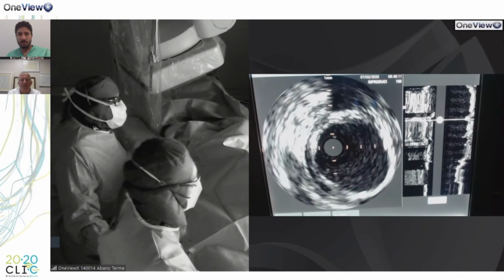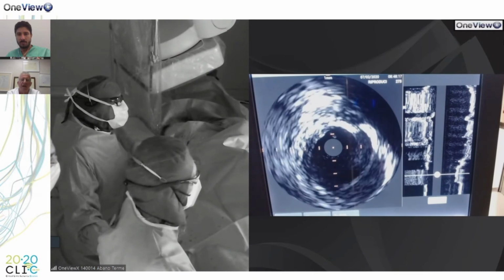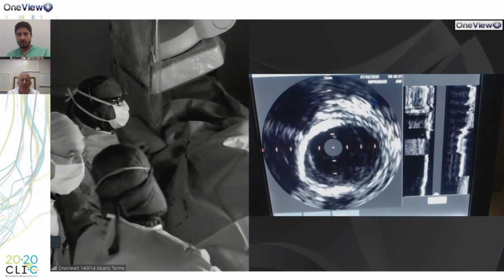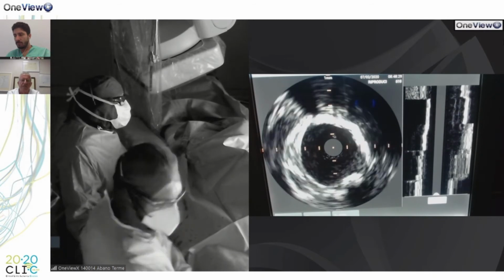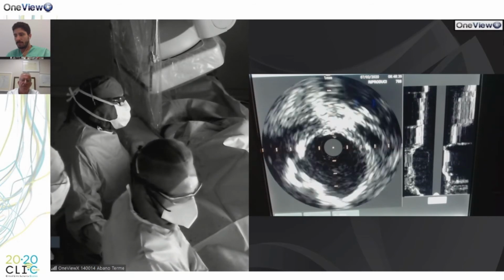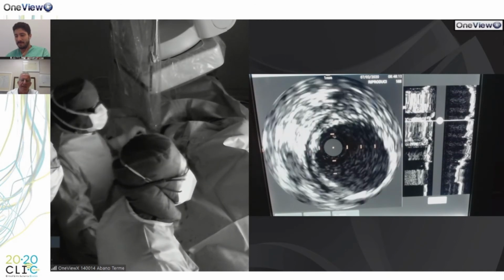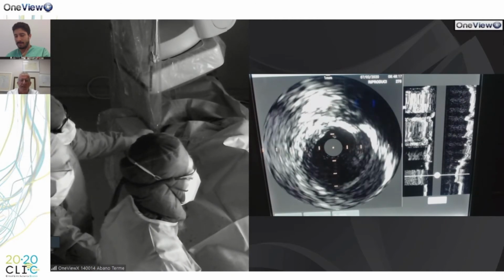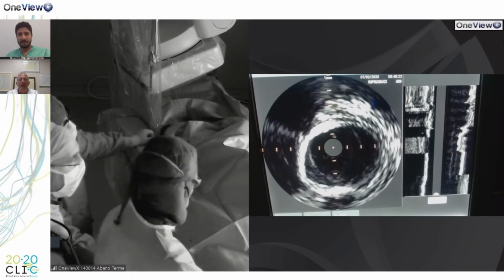It's a good imaging, and I think that you have to scaffold the lesion because you have to make space between the round calcification and the flap. In effect, it is there, and you have to treat it. But I don't know if the high pressure balloon could be the best solution for this. Maybe if you have a landing zone for stenting, you could think about putting a stent in this after, not using a big pressure balloon.